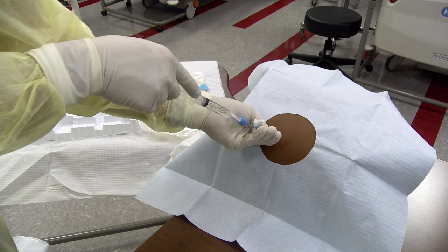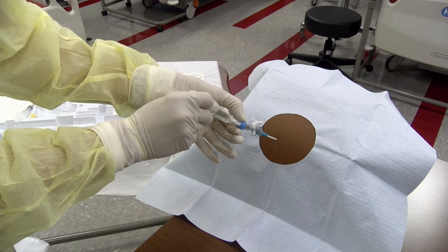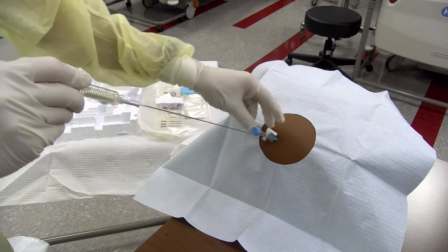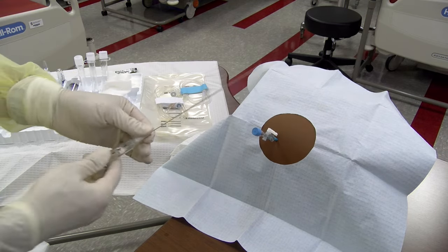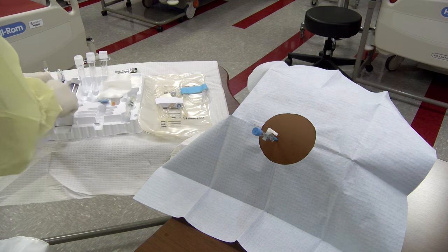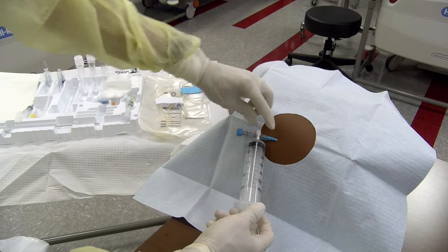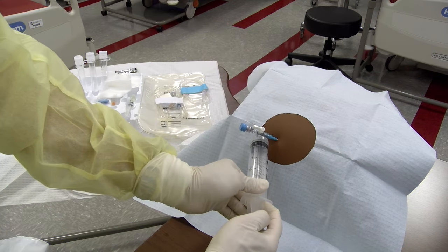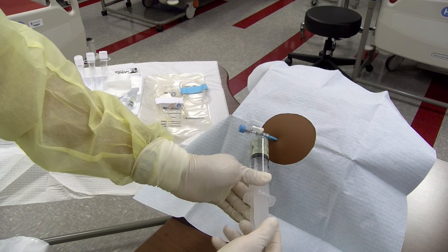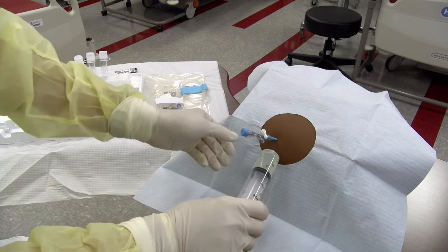Keep the hand controlling the syringe steady. Now advance the catheter forward — do not withdraw the needle. Once the catheter has been fully advanced, the needle may then be withdrawn. Turn the three-way stopcock off to the patient and connect a 60 cc syringe to the stopcock. Now you may withdraw samples to be sent for analysis. If cultures are being collected, be sure to inoculate the culture bottles at the bedside to increase the probability of isolating a bacterial organism.